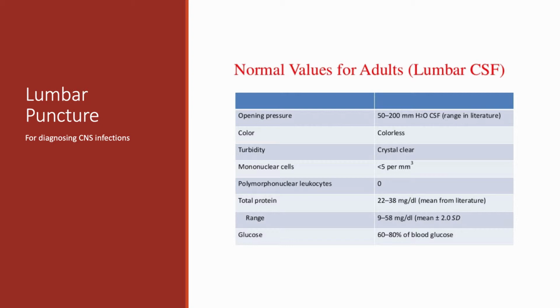There should be a couple of white cells in it here and there, and there should not be blood in it. But in fact, when you first put the needle in and look at the first couple drops, you put those first couple drops into a separate bottle, because there will be some blood in those. And then the blood should clear on the second and the third little bottle that they're taking the specimen from. So the first bottle usually has some blood in it just from the stick. The second bottle may have a couple of remnant red cells left. But by the third bottle, and these bottles are tiny, I mean, it's like just a couple of drops in each, you should have no blood.